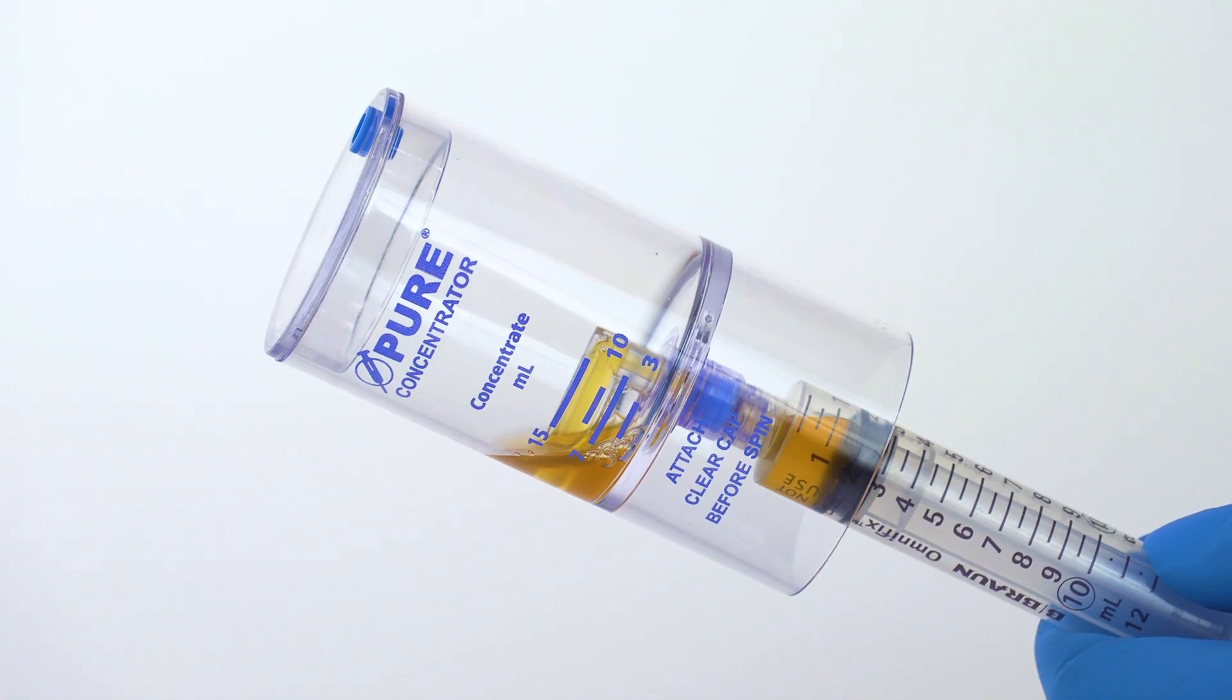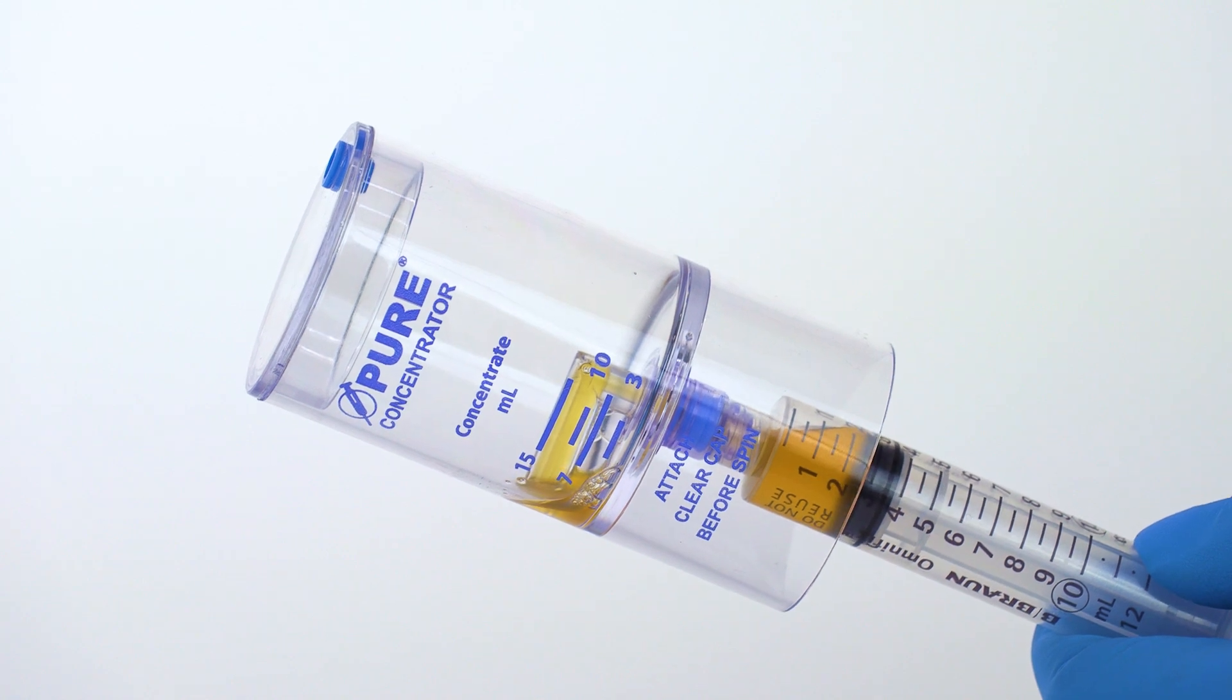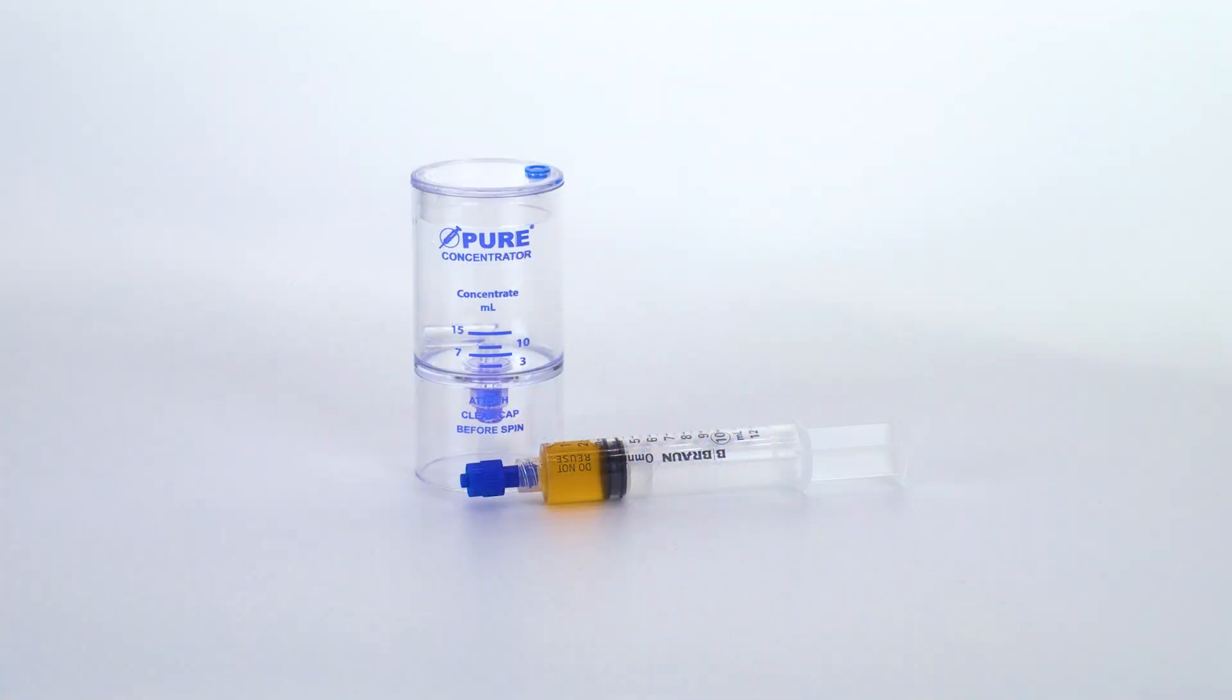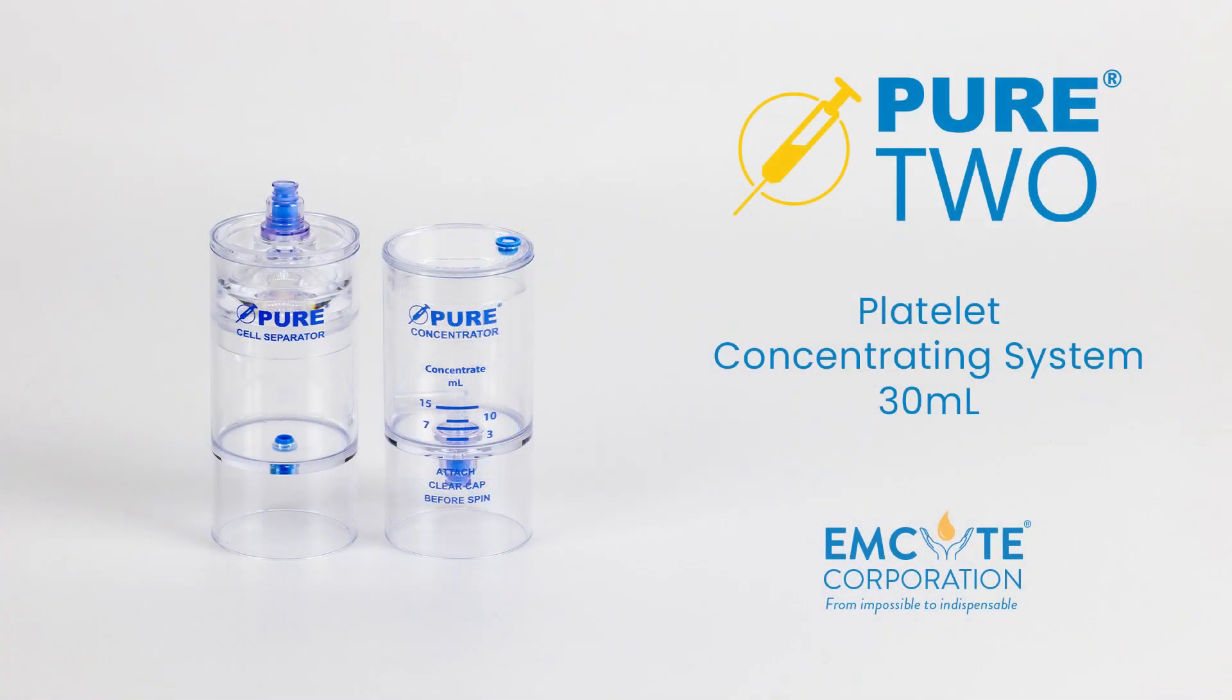Attach the 12 milliliter syringe to the needleless port and tilt the device to aspirate the PRP. This concludes our processing video for EmCyte's Pure 2 processing system.